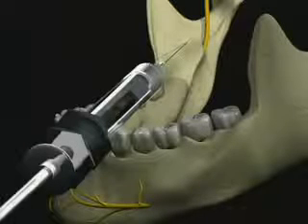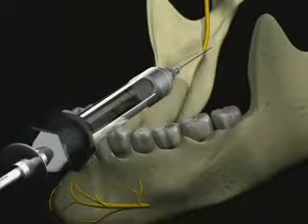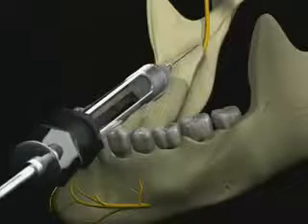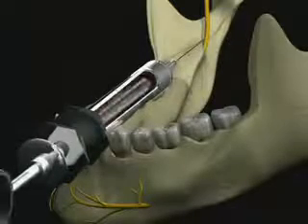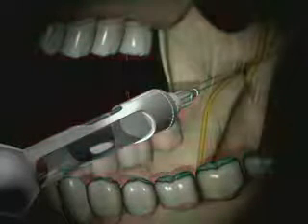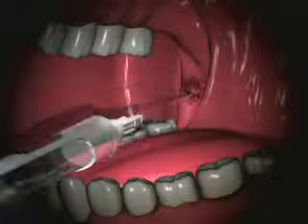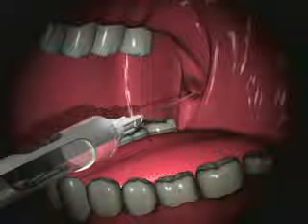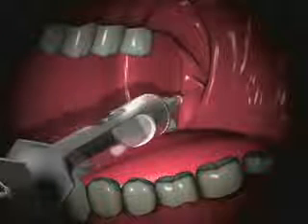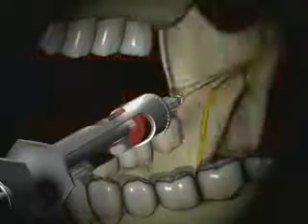This is accomplished by withdrawing the syringe slightly, moving the barrel more medially over the contralateral canine or incisors, and advancing again until bone is contacted. If you do not contact bone after 25 millimeters, and the needle is almost buried, you should redirect by withdrawing somewhat, but not completely, and move the barrel of the syringe more laterally and advance again until bone is contacted. You should repeat this procedure as necessary.